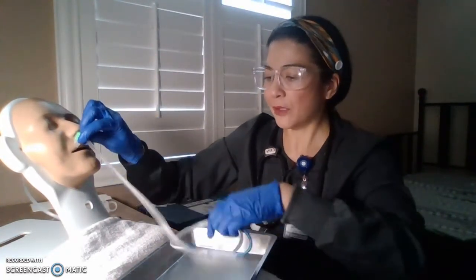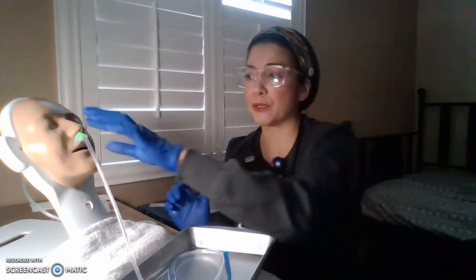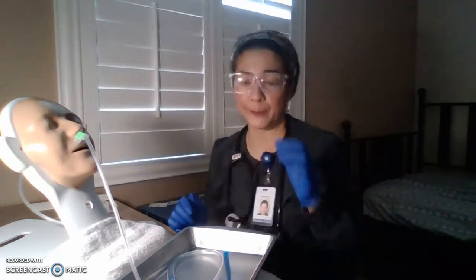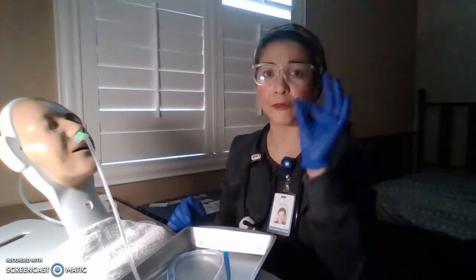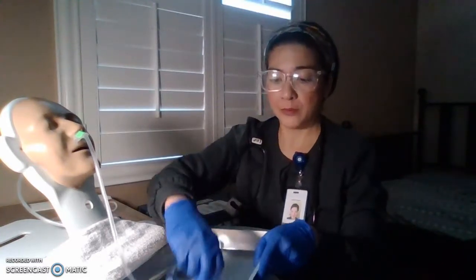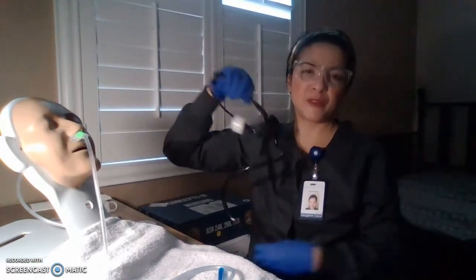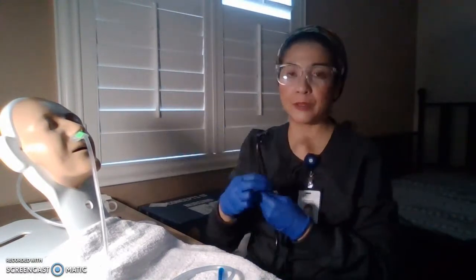All right. So now what are we going to do? We are now going to confirm placement. Okay, once we've reached that point. And how do we do that? 3 ways. First, we can use auscultation, which is not preferred anymore, but do it still.